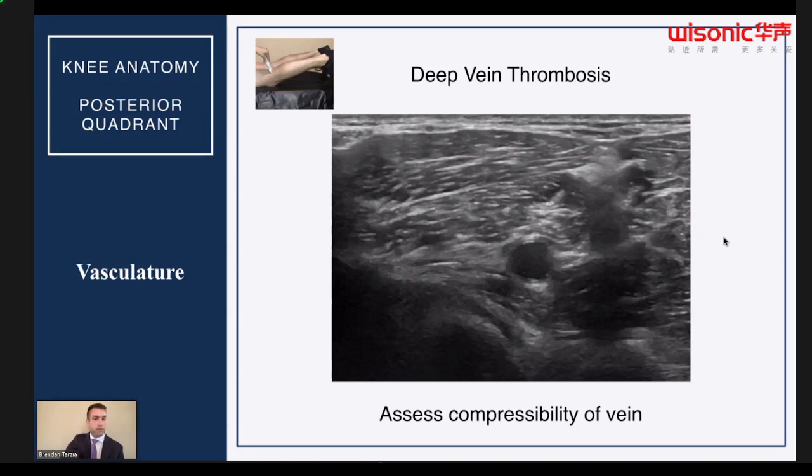One of the reasons that you do this is you want to see if a person has a blood clot in their legs, or a deep vein thrombosis. This is another study that we do all the time in the emergency department, just to look for any evidence of deep vein thrombosis. You're going to do at least 3 spots in the leg. If you're doing point of care ultrasound, 3 to 4 spots in the leg. You're going to do proximal, mid, and this popliteal crease at least.